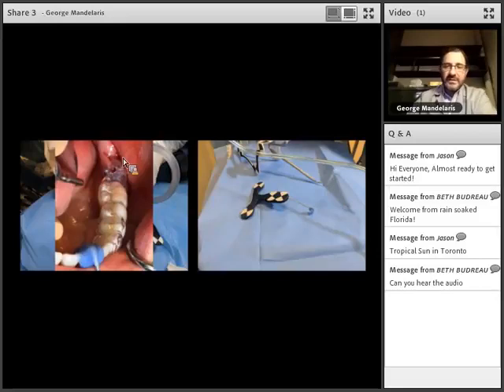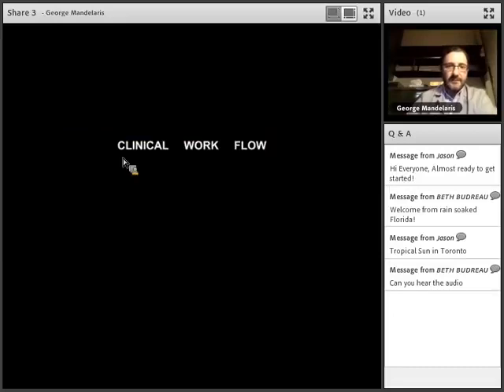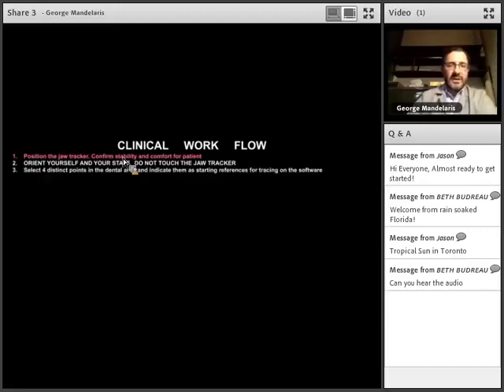And when we're done with the surgery, it's very simple to just remove the jaw tracker. It comes off very, very nicely, very clean. So the clinical workflow, as I see it and how I use it in my practice: the first thing that I do is position that jaw tracker, confirm its stability and comfort for the patient. I'll orient myself and my staff. I try not to touch it when possible, and everybody kind of knows where it's at.